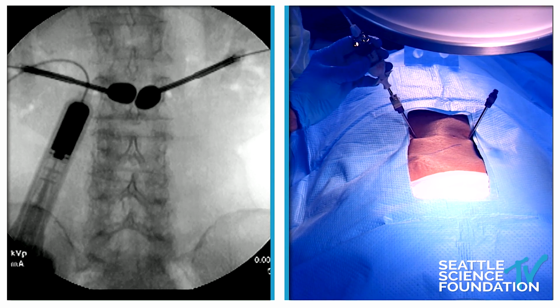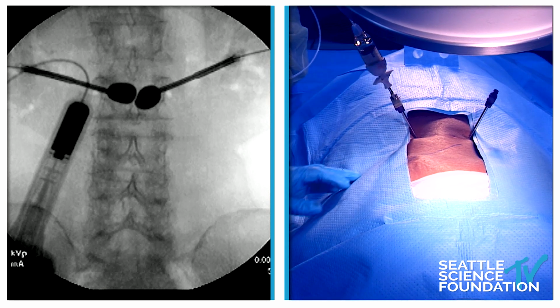That's okay. We can do one at a time. Do we have two mixed? There's one box of cement. That's okay. We'll do one at a time.